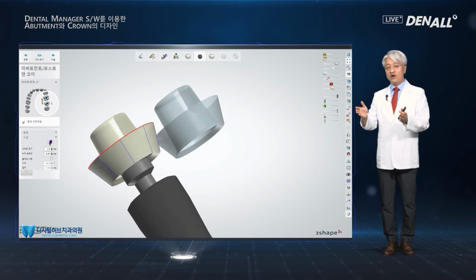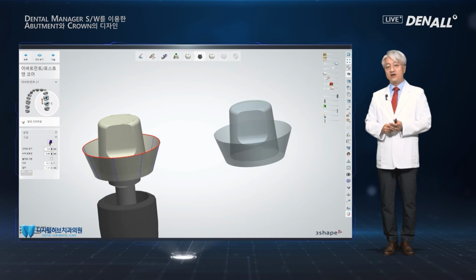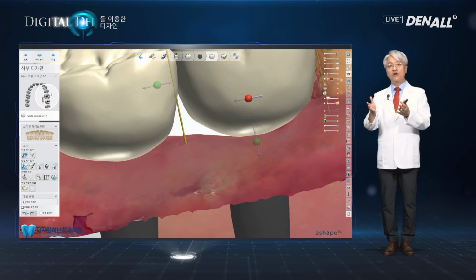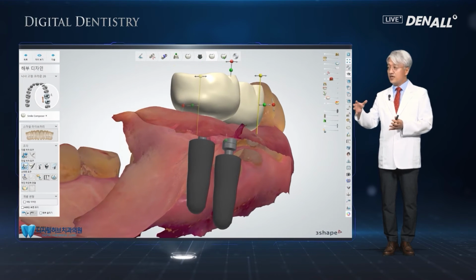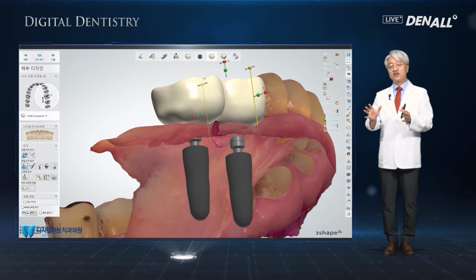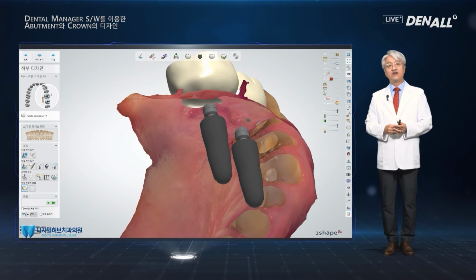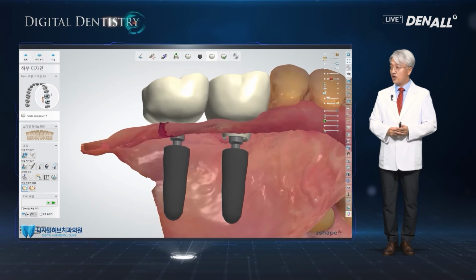because the tooth formed from the abutment margin is printed as temporary, and the temporary can be easily reduced or added depending on the gingiva shape or the tooth contour. The modifications can be made easily before final prosthesis is delivered, depending on the surrounding environment or fixtures, and any errors or deficiencies can be corrected between a couple of months to 6 months before final prosthesis is mounted. So I use stock abutments a lot.